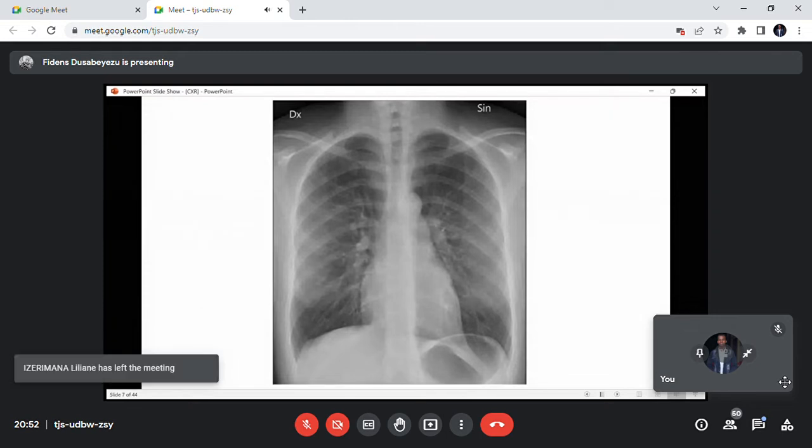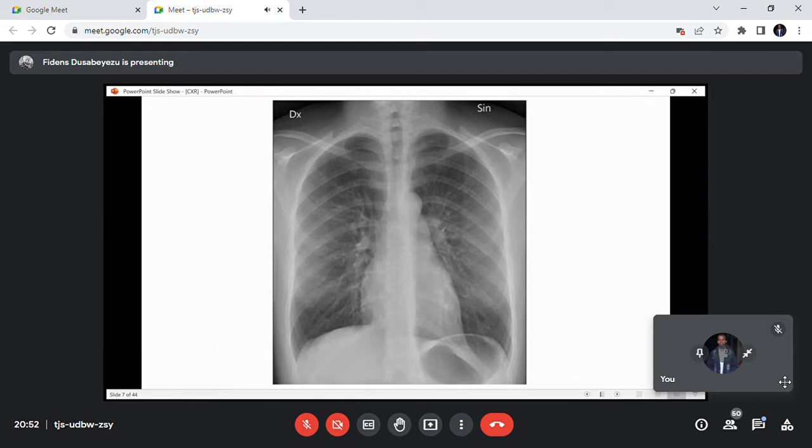So it is up to the doctor, the clinician, the one ordering the exam, to write on the paper request form that I need a chest radiograph in expiration. Because if we don't say so, the technician will never do it himself. And I will just read it at the end without even knowing what's happening.